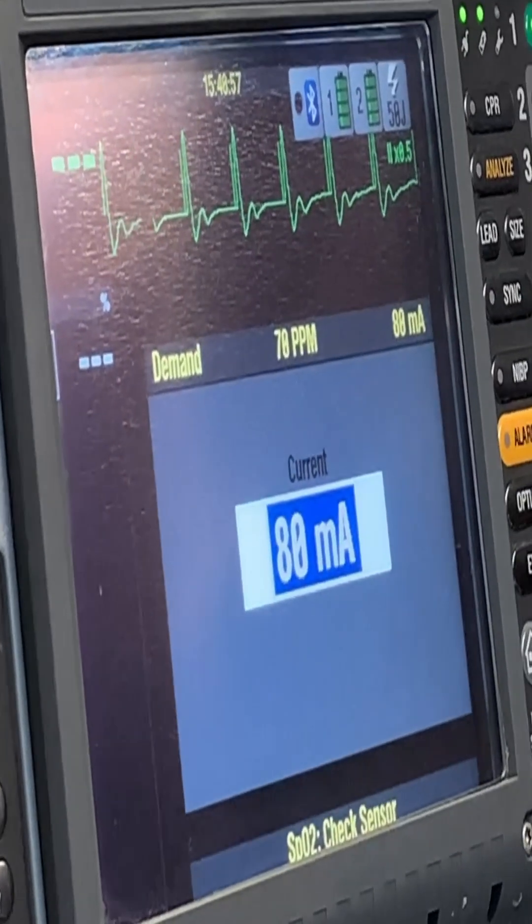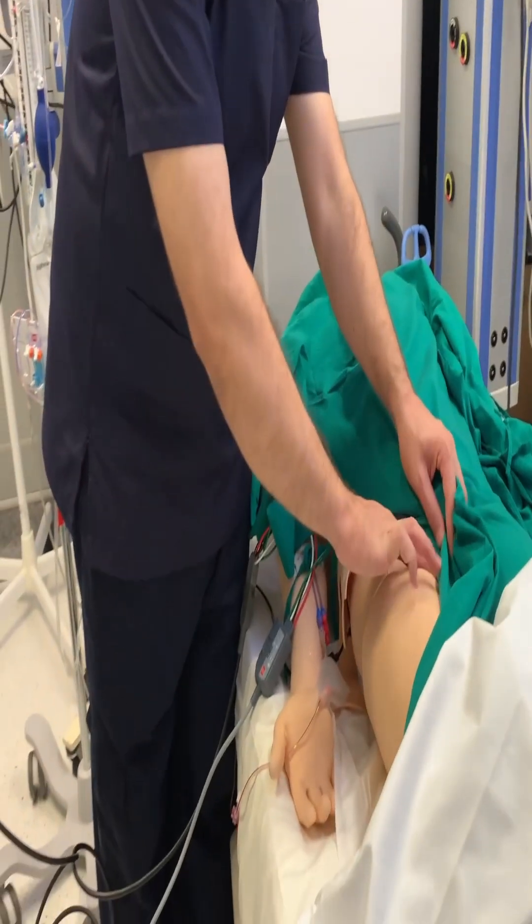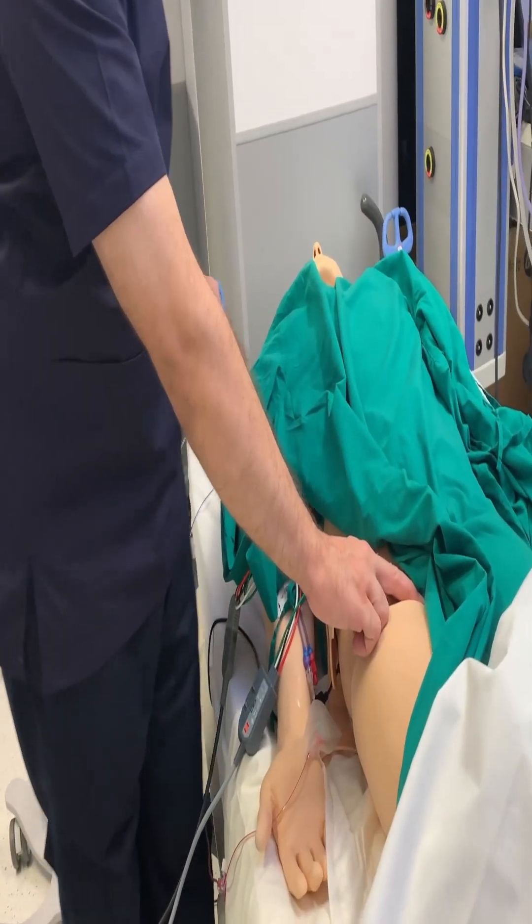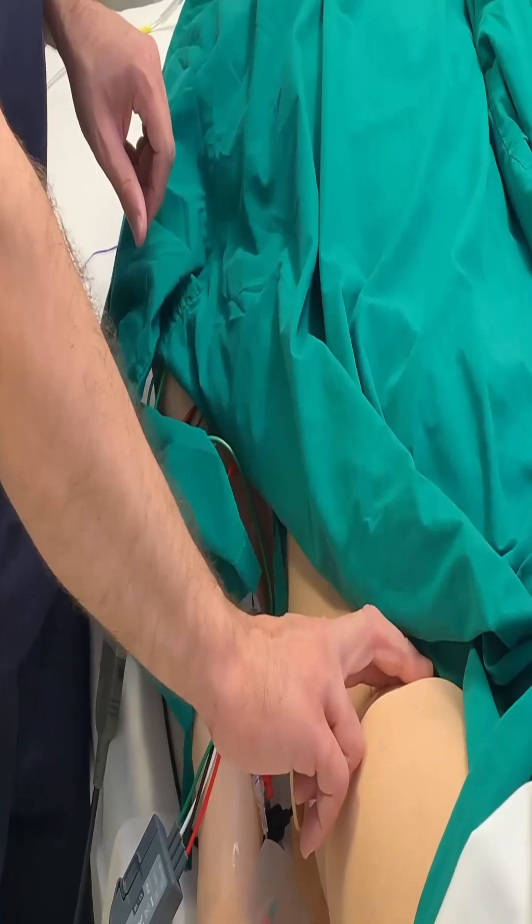Once satisfied with capture, check that electrical activity is followed by mechanical activity. Check the pulse — the best sites are the femoral, carotid, or radial. Note that the pulse check may be interrupted by muscle contractions from the pacing. Finally, increase the milliamperes by about ten percent — for example, if it is 90, make it 100 — to ensure the patient's pacing will not be compromised.